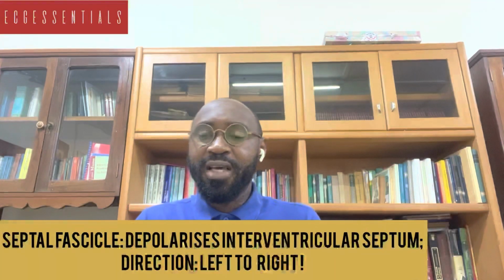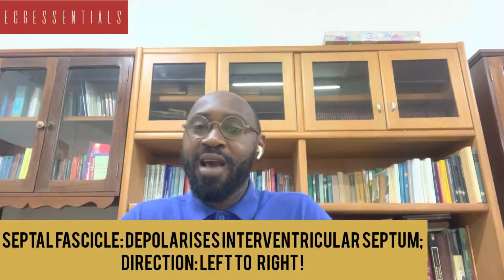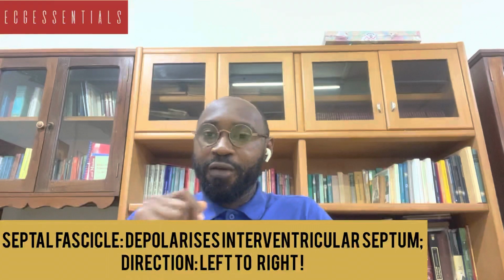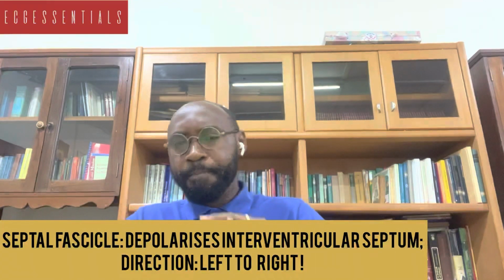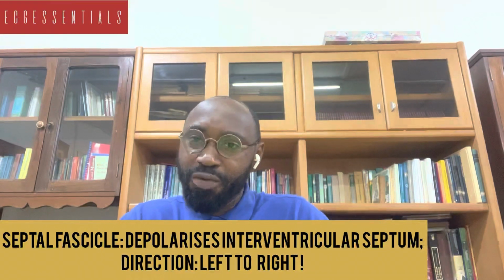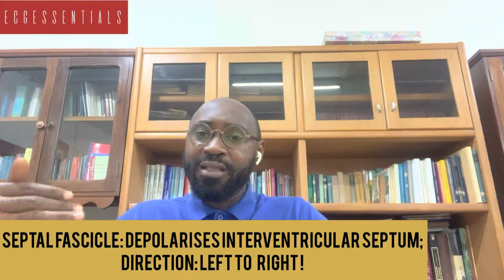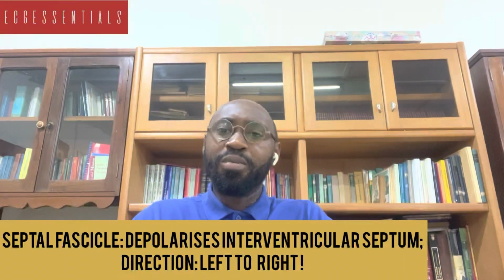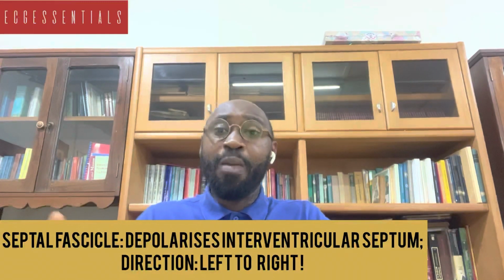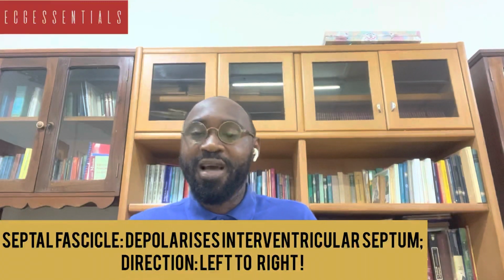The movement of electrical information is such that the interventricular septum is first to depolarize, and the orientation of this overall vector is from the left side to the right side. So what that means is that electrical activity is moving away from leads or electrodes that are more on the left side to those that are on the right side.